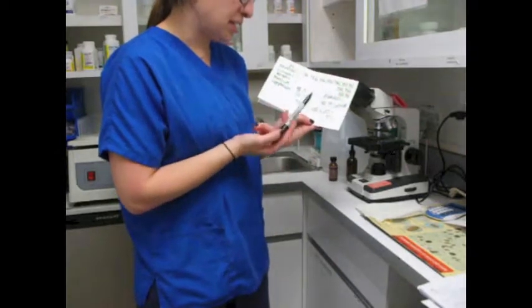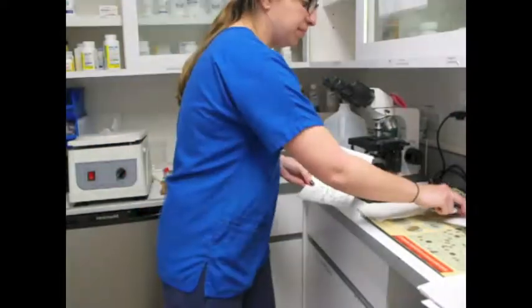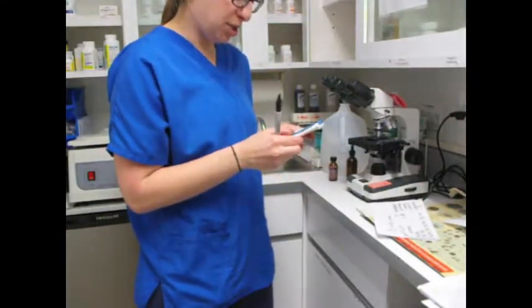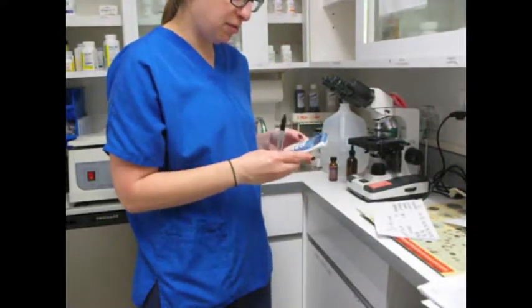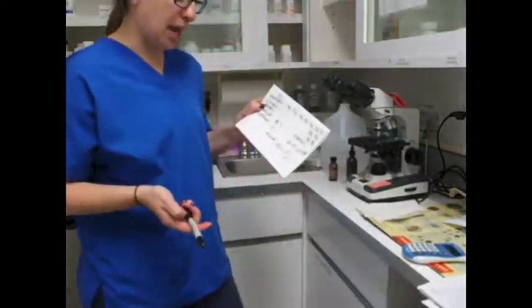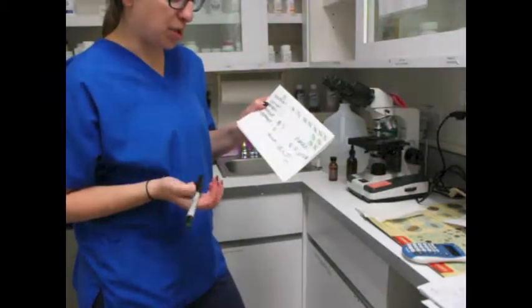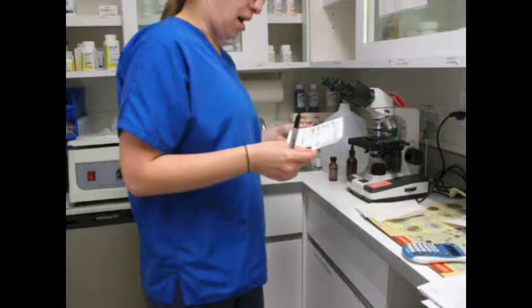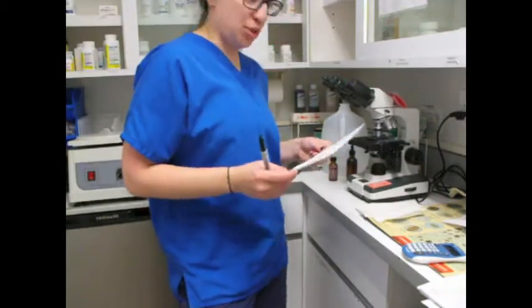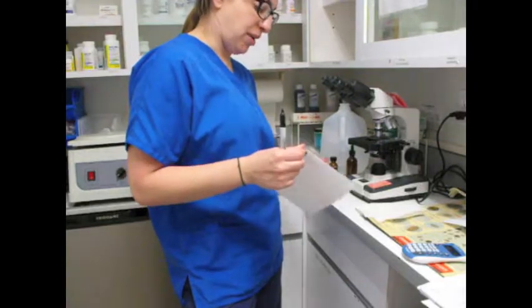So for the monocytes, there were 5. It would be 100 times 0.05, which would equal 5. And then lastly, the lymphocyte would be 100 times 0.10, which would equal 10. So that is how you would do that, and that is how you would take the absolute values.